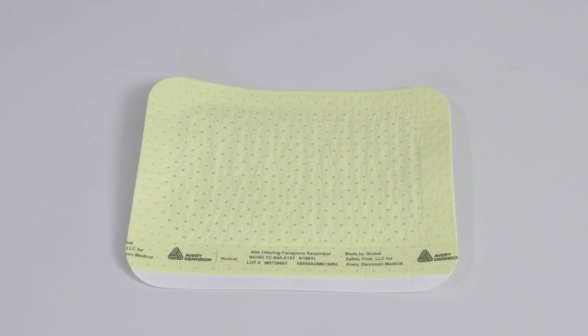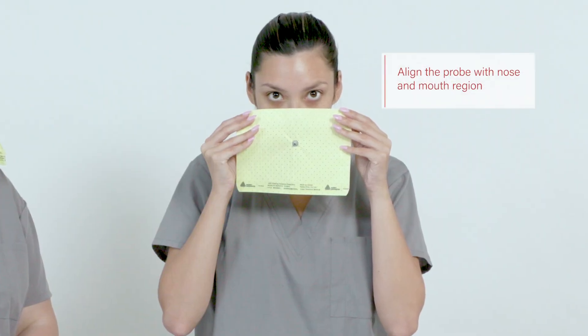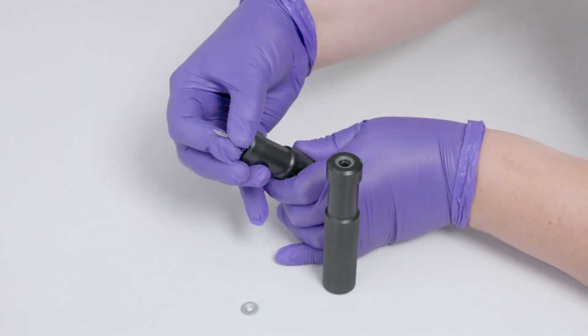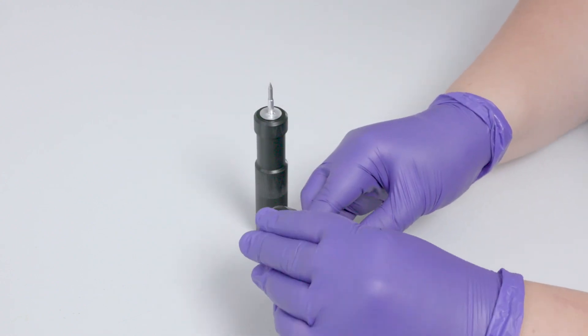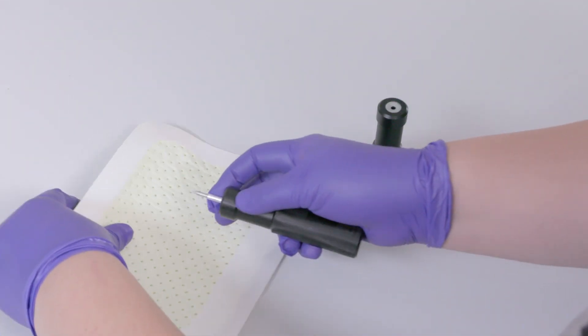Step three: attach the probe to the mask. Be sure to use a new, unused mask for the fit test. Hold the mask up to the test subject's face to determine the proper location for the probe — the probe should align with the nose and mouth region. Use the probe assembly tool to insert the probe into the mask. Make sure the flat side of the probe faces the inside of the mask.